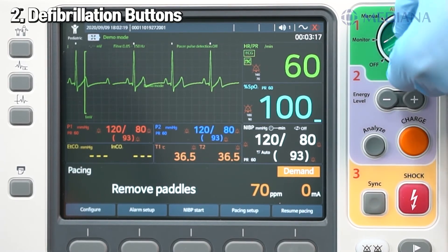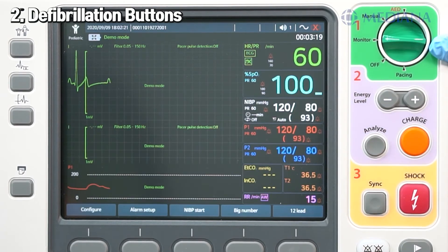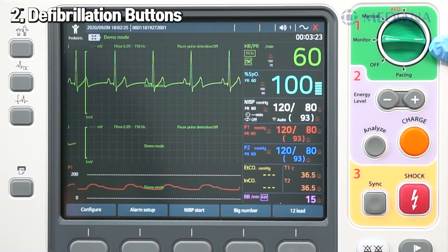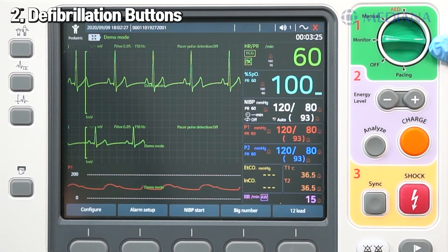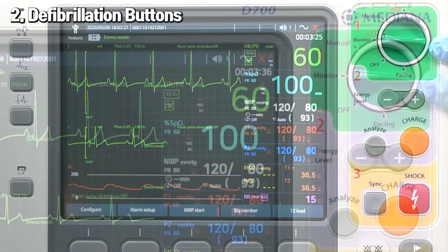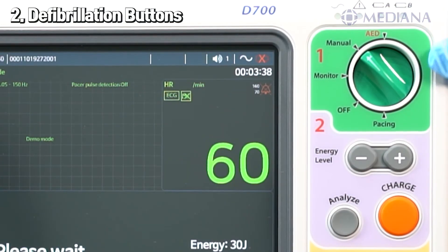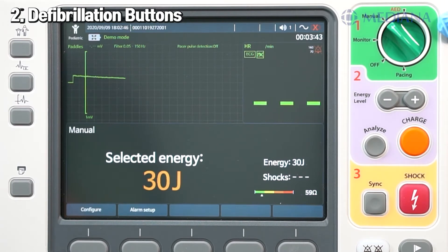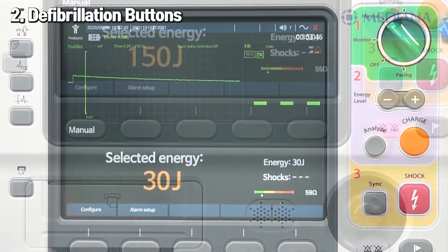In monitor mode, the full range of monitoring options is available, including 3, 5, and 12-lead ECG, SpO2, NIBP, IBP, temperature, and ETCO2. In manual mode, there are operating mode, instruction message, contact indicator, number of shocks, energy level, and sync mode display.